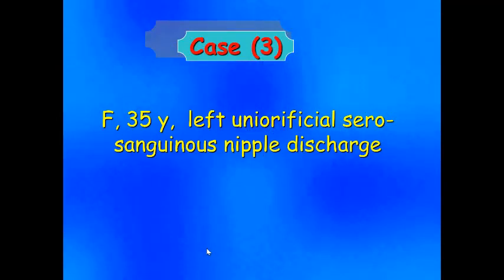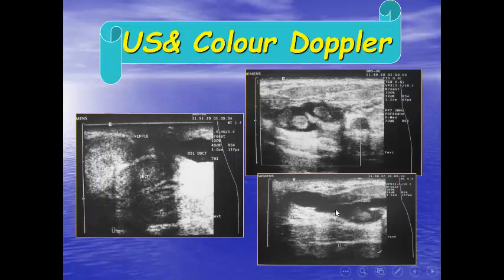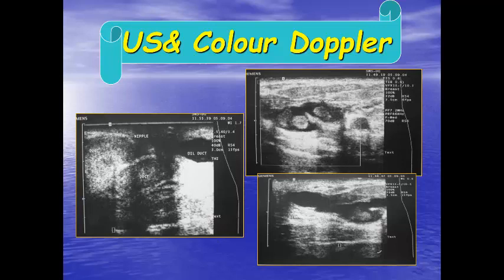Another case: a 35-year-old with left uni-orificial serosanguinous nipple discharge. Galactography shows the duct with a regular outline, and no filling defects are identified. On ultrasound, this is the typical appearance of inspissated secretions: ball-like, echogenic, non-dependent, and not attached to the wall. To confirm inspissated secretions, you can assign BIRADS 3 for close follow-up, or ask the patient to squeeze her breast — the inspissated secretions will change in position. Palpation with the probe also changes their appearance.